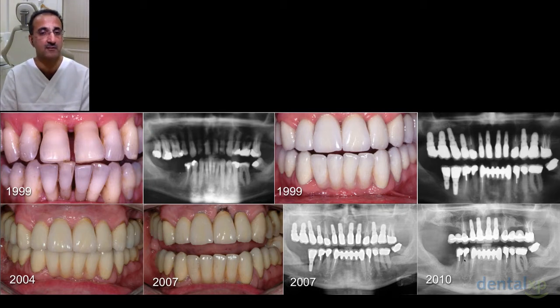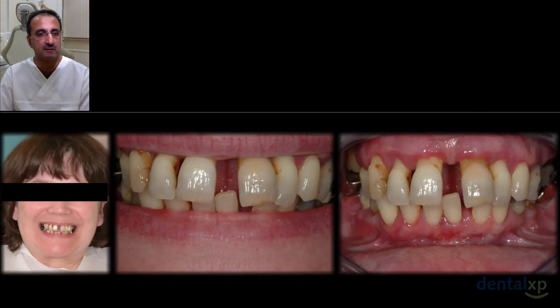And I have to say in 2011 or 12, we removed all the upper implants, and the lower implants were lost already. And now we are redoing the treatment with new graft and new implants, and of course a different kind of prosthetic approach because we've lost a lot of tissue. So this is perhaps my worst nightmare case, and I would say my biggest failure in this respect. But nevertheless, we learn, and we perhaps treat this differently today. So let's go forwards and look at our patients.